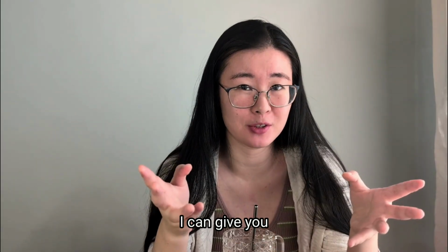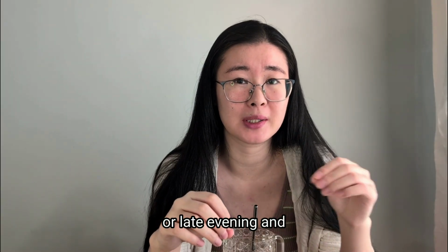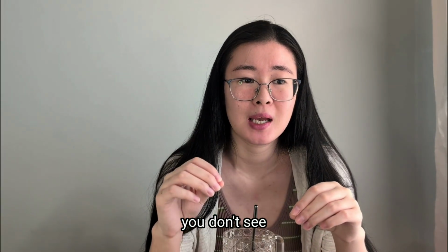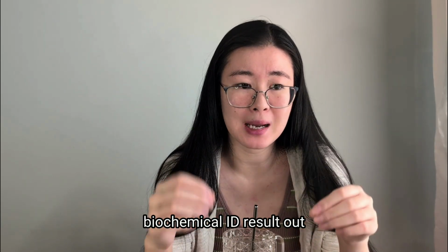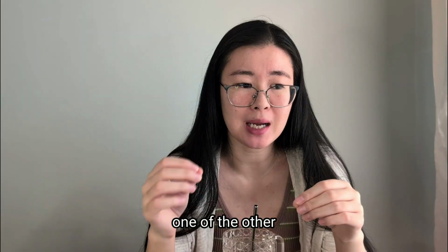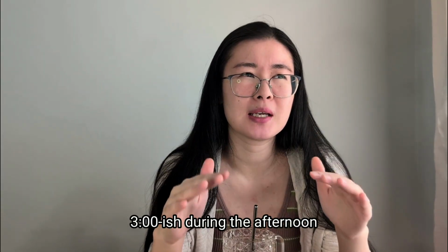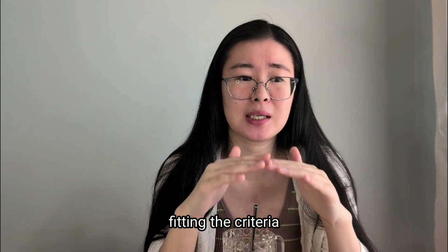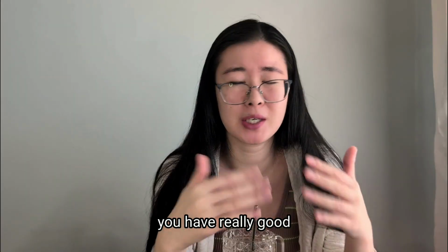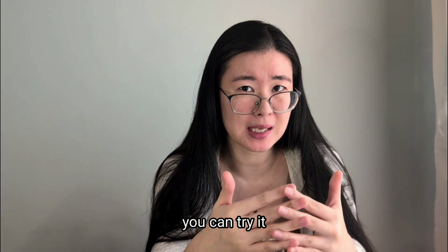One of the tips I can give you for this kind of scenario is if you send us a sample during the early night or late evening and you don't see an ID or biochemical ID result out by the second day in the morning, one of the other things you can do is, by 2 or 3 o'clock-ish in the afternoon, give microbiology a call. If your patient is fitting the criteria, really urgent, or you have really good reason that you definitely need the plates to be read, you can try it again before everybody's gone.